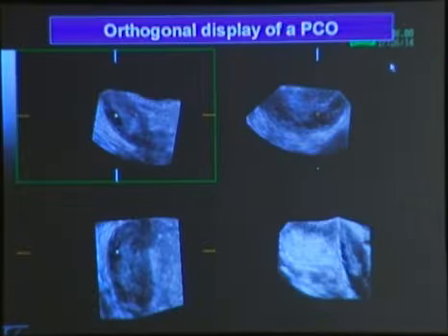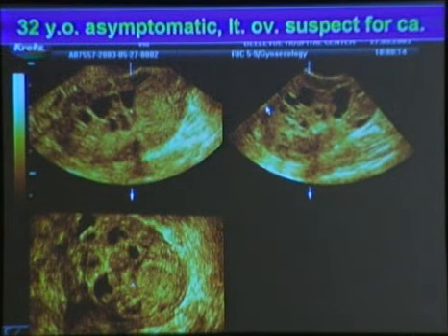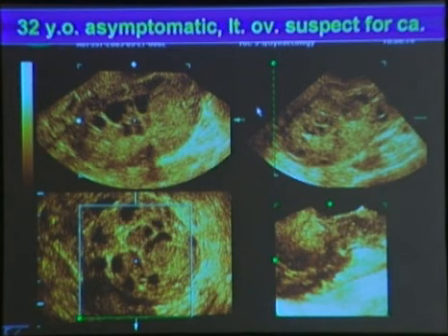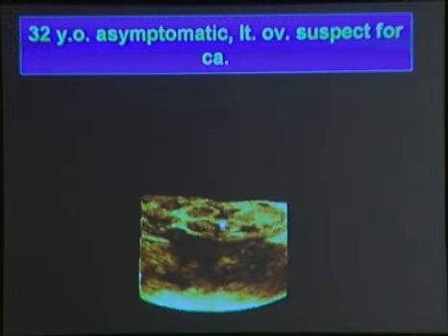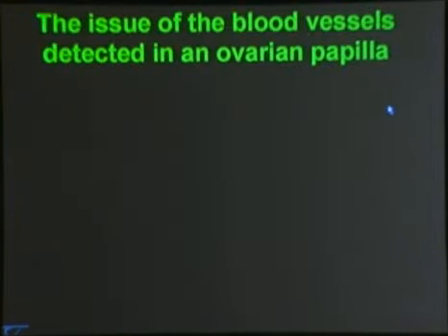Now, ultrasound and the ovary. For many years, again, I doubted that 3D will give anything at the ovaries. But we learned a lot from the pathologist. And what the pathologist does, takes an ovary, puts it on the cutting board, cuts it in two, and then turns it and looks at the surface. That's what you can do with 3D also, very simply.